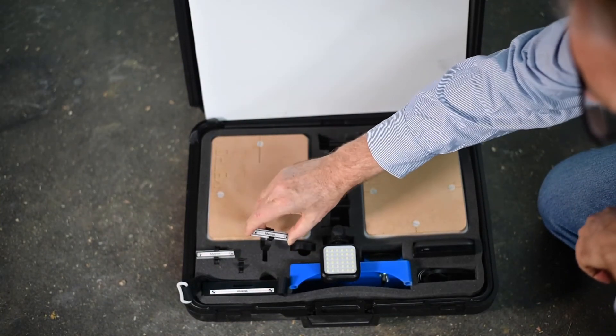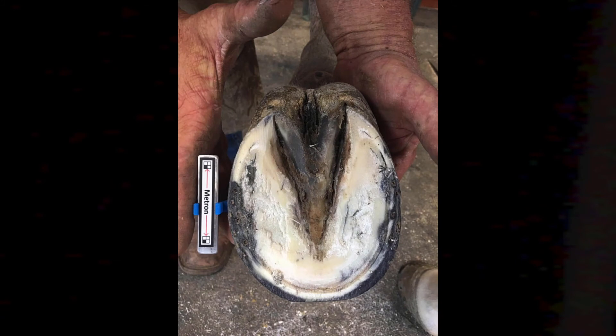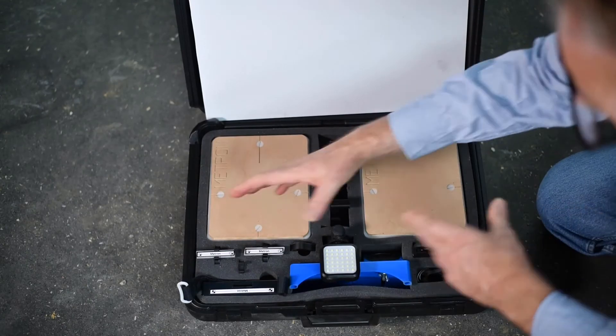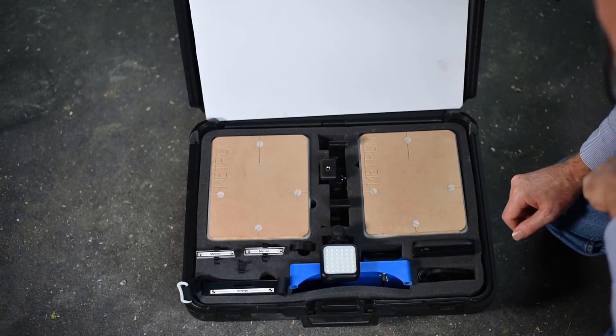These are so-called finger clips, and there are alternate size finger rings that you slide them on. This is for the solar photo of the hoof — you hold the hoof, you put this on your finger, and you have this scale marker in the plane of the hoof. That's used for photographing the sole of the foot.